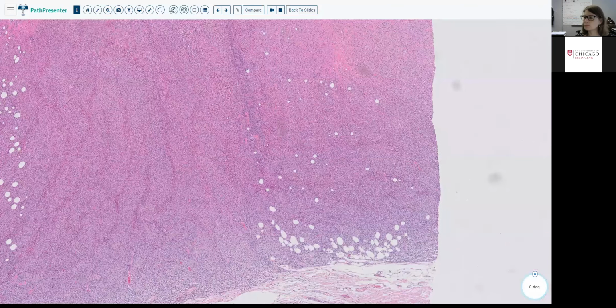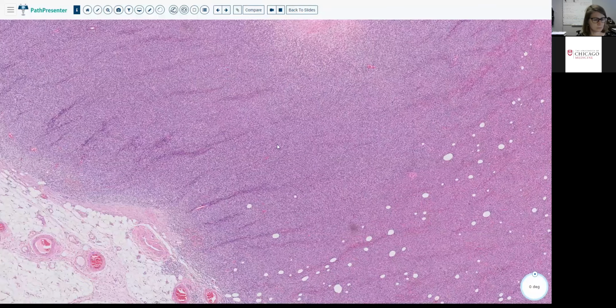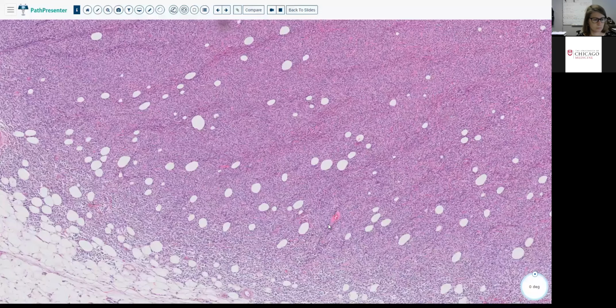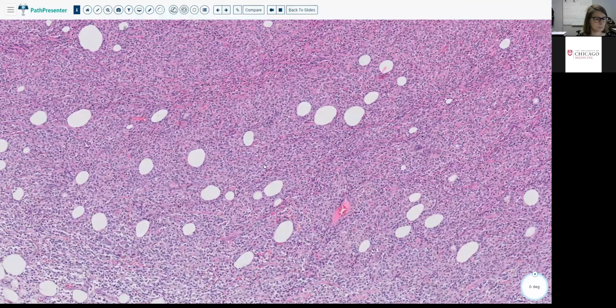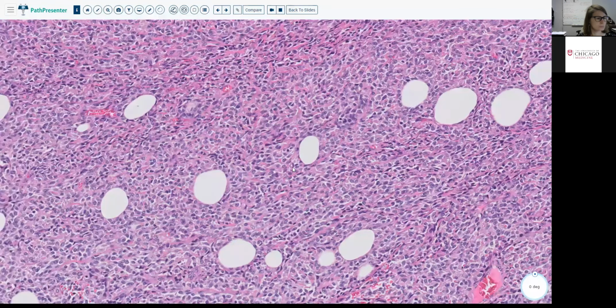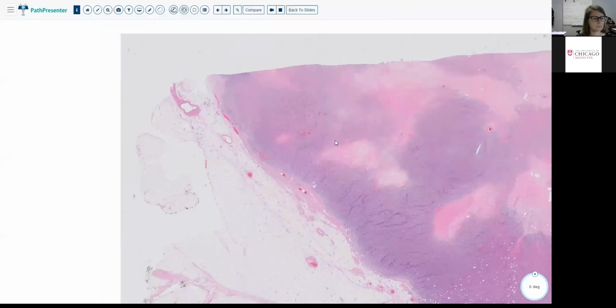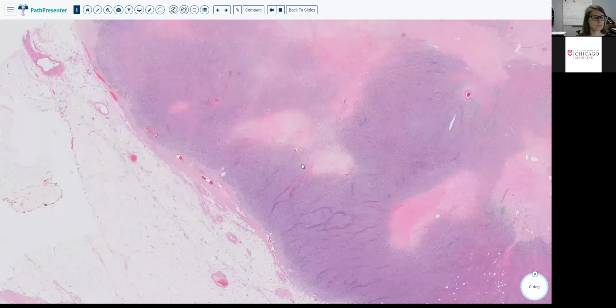I'll go first if no one else wants to. We have a very highly cellular lesion that's apparent. I'm not sure if it's invading fat. There are some fatty vacuoles in between, so it looks like it's invasive of the fat. I'm not sure what the anatomic site is. It doesn't look clearly like a subcutaneous lesion, so I can't start to try to put this in DFSP territory.